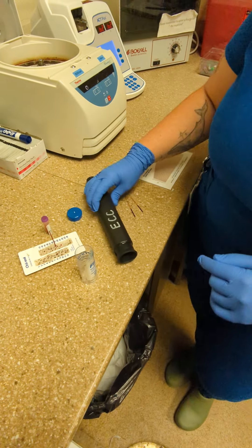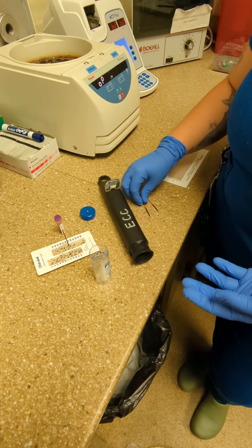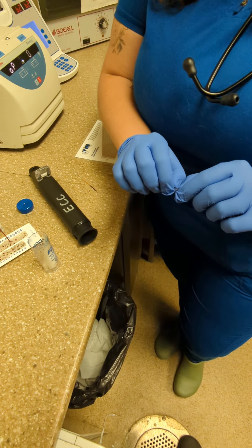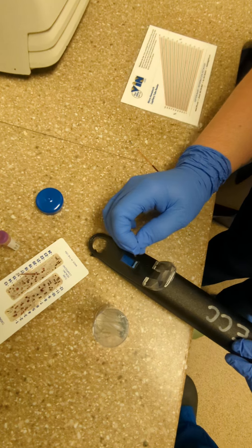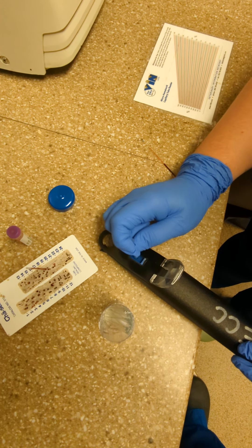To read the total solids or total protein, use a refractometer. To break the tubes, go where the blood meets the plasma, just a little over the blood, and break outwards. To get it onto the refractometer, don't touch it — just slam your wrist down until it comes out.